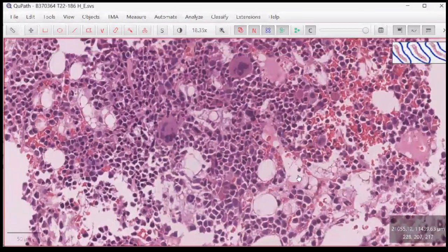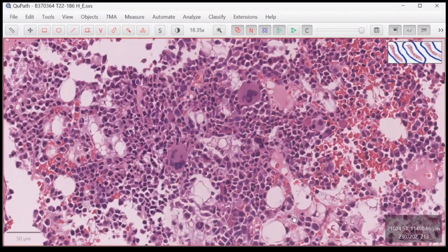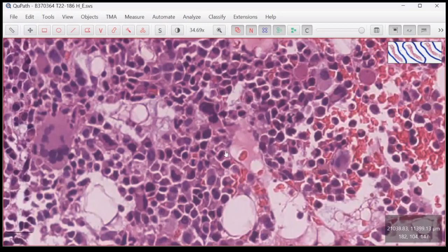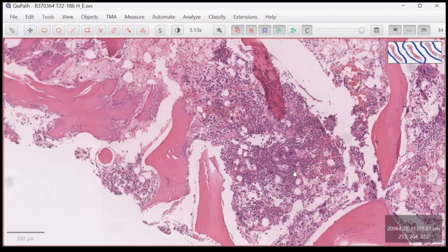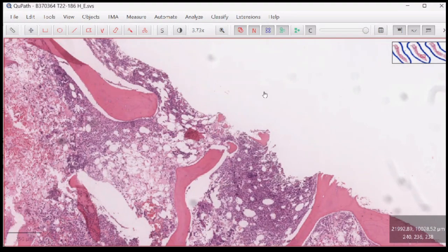Okay. If you have CD99 here, apart from granulocytes which show maturation, and then the remaining cells are probably regenerating, then you have to be very careful in interpreting CD99. You still have patchy areas of hypocellular marrow.